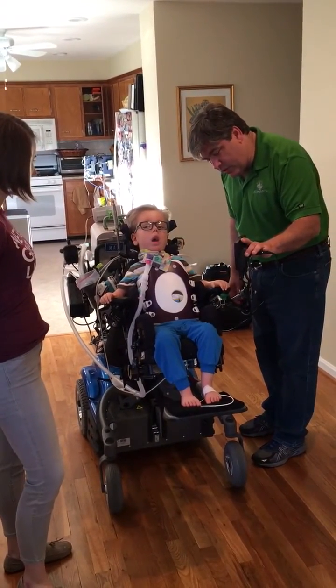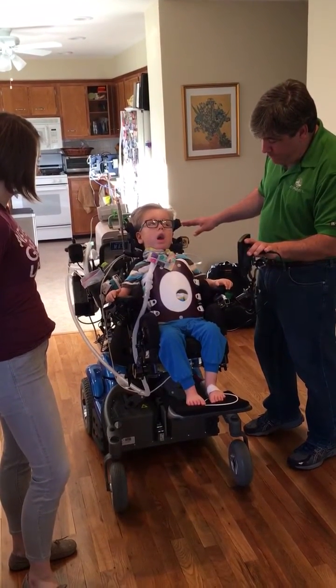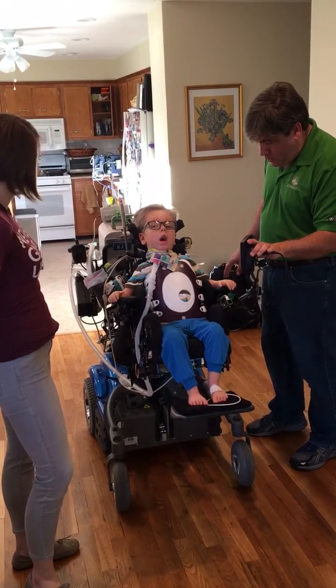So, I'm going to put this into your control. Don't worry. I'm going to be right here at these controls, and I can take over right away if I have to, okay? You good? You trust me? Up, up, up, and on. Good. Very good.